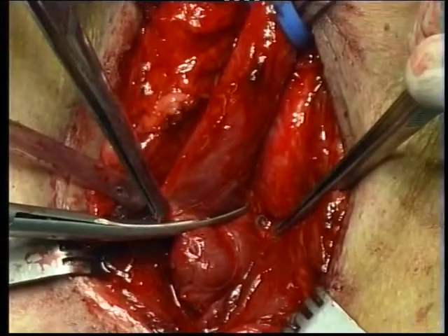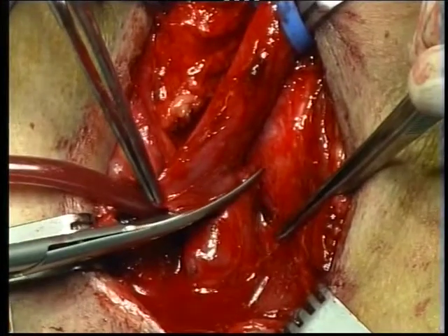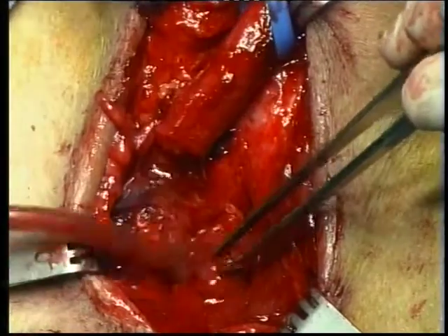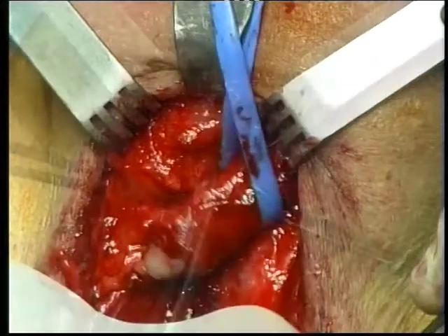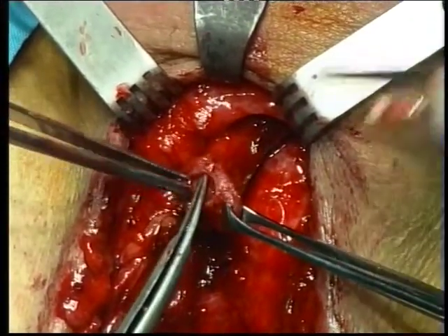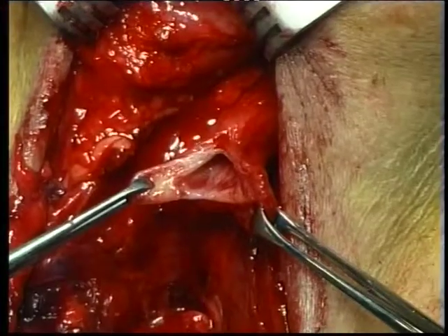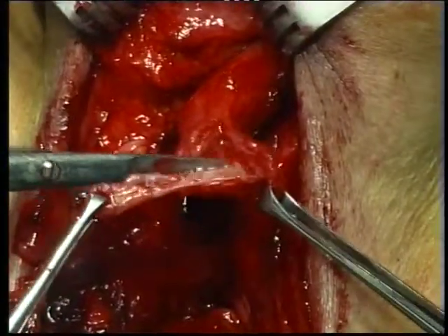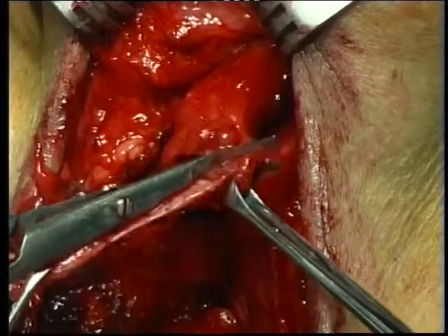After adequate proximal mobilization, the stricture is localized by means of a Benique sound and divided perpendicularly at this point. We can perfectly see the limited urethral caliber at the stricture site. The stricture should be incised longitudinally and the incision carried distally through the stricture until normal urethra is identified. Thereafter, the strictured urethra should be excised to perform the anastomosis with spongiofibrosis-free tissue.